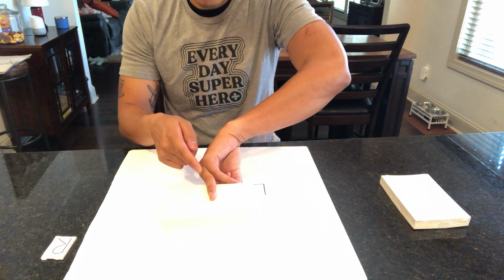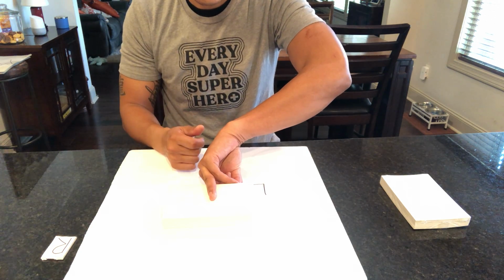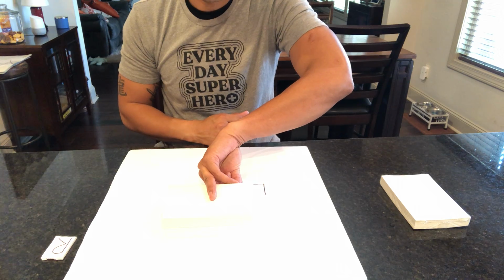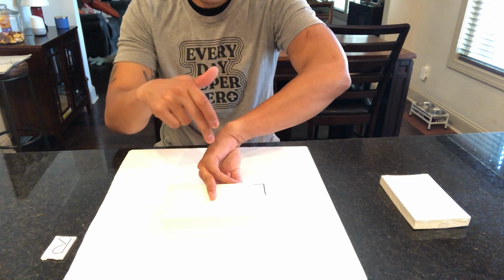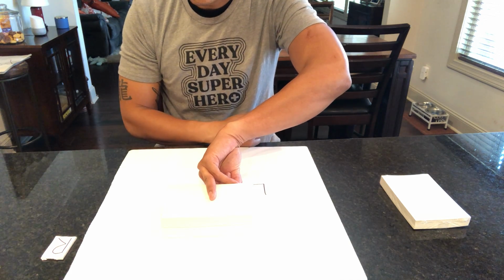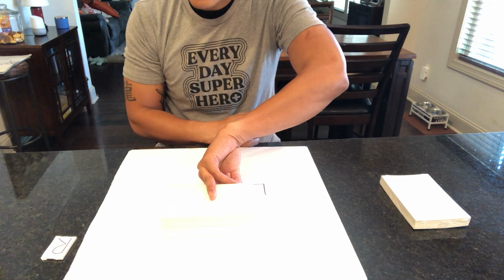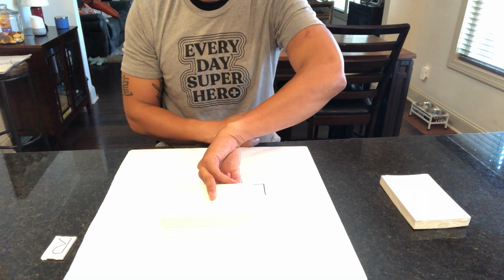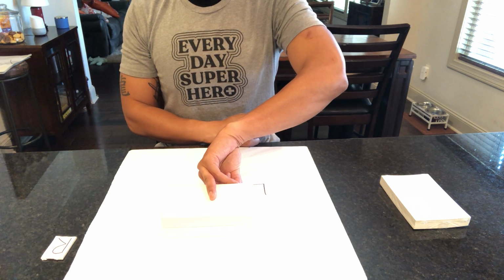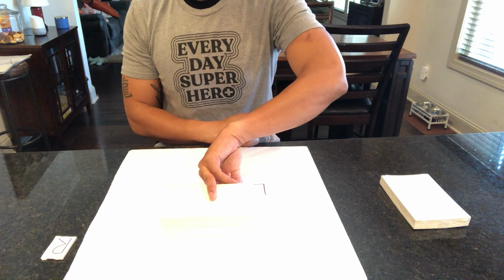So if you're looking at the 4th and 5th digit, you're going to be looking at the ulnar surface. If you were to do the 2nd or 3rd digit, you would be looking at the radial surface. So again here, central ray is perpendicular to the PIP joint. We're going to keep the affected finger parallel to the film plane. And again, the anatomy we're viewing is the lateral projection of the phalange, distal metacarpal, and its articulations. So those are your finger projections.